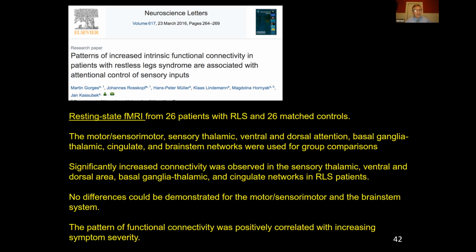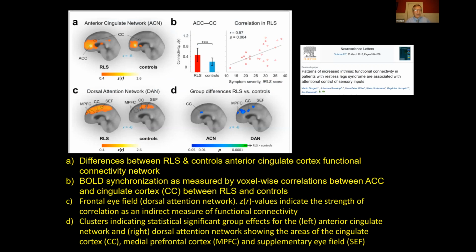And this is, again, a little bit more fMRI work. I won't perseverate on it, but we can see the anterior cingulate cortex under the letter A here on the left. So there's a very heightened level of activity in that area. And that was thought to be related to some of these symptoms of pins and needles or uncomfortable legs. The dorsal attention network, this is one of these regions of the brain that we use to focus on. There's still not complete agreement on how that region might be tied in. But again, this was something that showed increased activity. Maybe people had a greater self-awareness.